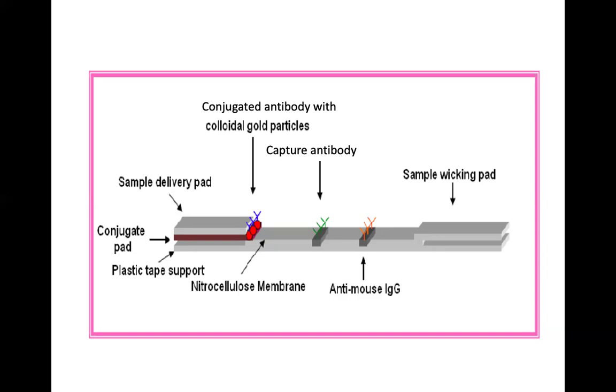You might be working with serum, urine, or whole blood. For us, we have experience working with sputum sample, which is very viscous.